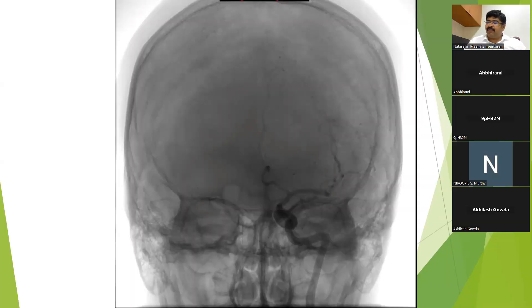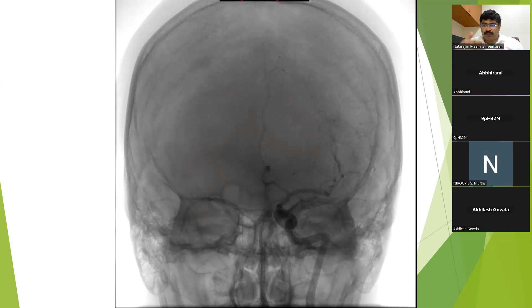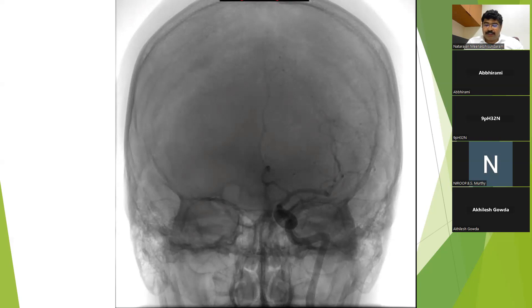In the DSA, we have multiple projections to get a 3D orientation of the vasculature and thereby a 3D orientation of the aneurysms. One is the frontal posterior anterior projection, then you have a lateral projection, a transorbital oblique projection, a reverse transorbital oblique projection, and then the cross-compression ICA sequences. These are the four main views which we use in a case of a DSA.